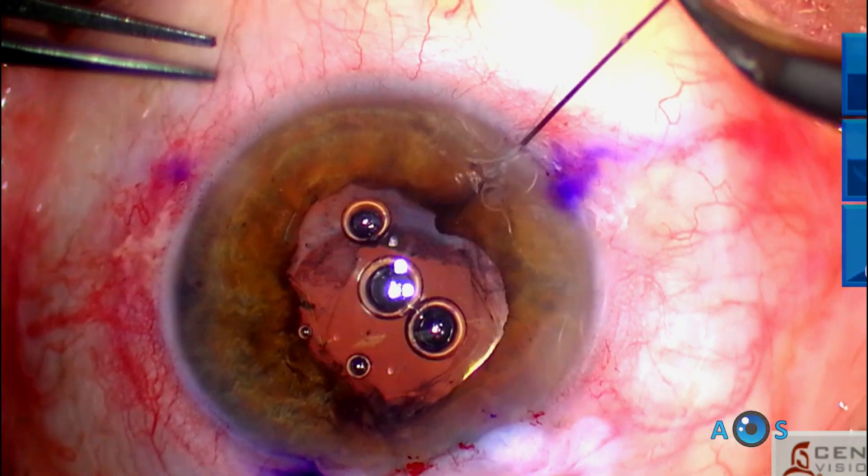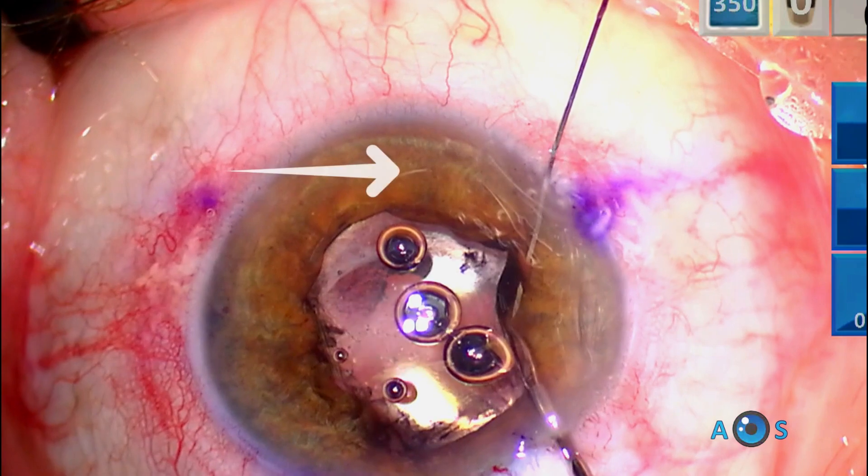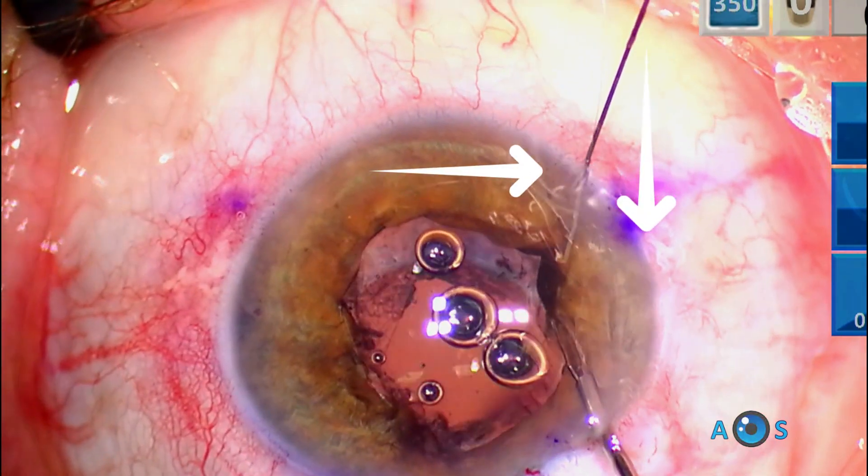Now we go back to the first needle, which will be directed upwards in order to complete the intended trajectory of this needle, capturing the inferior and nasal sides of the pupil.